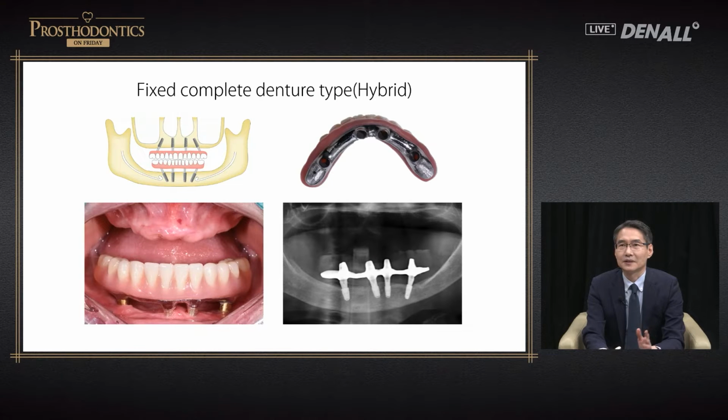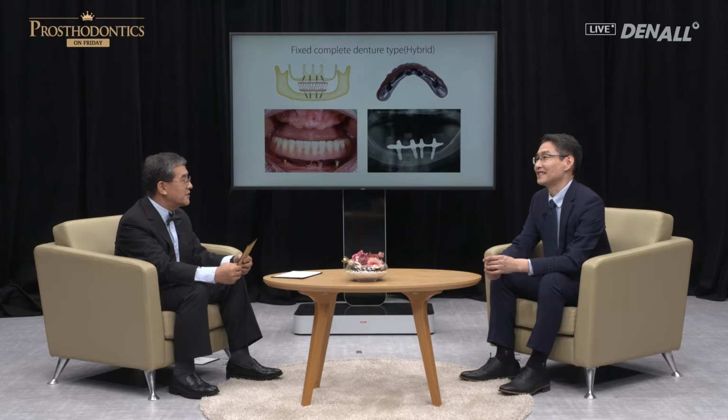Please carry on. There are a couple of formats to follow when you restore a fully edentulous patient. This was an 80-year-old female patient. In upper and lower, full dentures were used. The bone width and position for implant placement were quite limited. Four implants were placed to do a somewhat traditional Branemark hybrid type prosthesis. Resin curing was done. Artificial teeth were aligned like this.